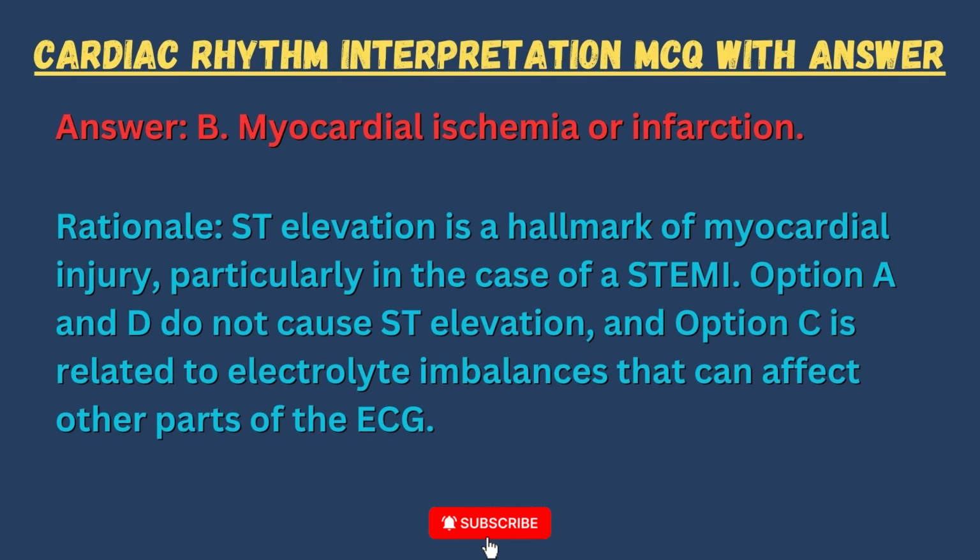Answer. B. Myocardial ischemia or infarction. Rationale. ST elevation is a hallmark of myocardial injury, particularly in the case of a STEMI. Options A and D do not cause ST elevation, and option C is related to electrolyte imbalances that can affect other parts of the ECG.